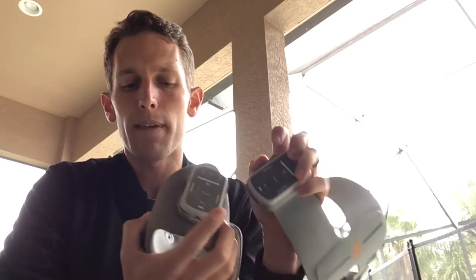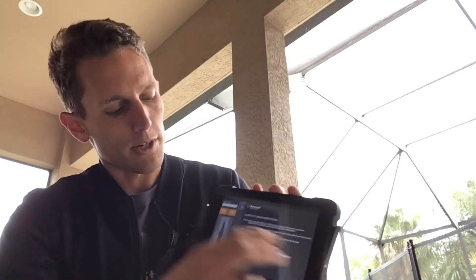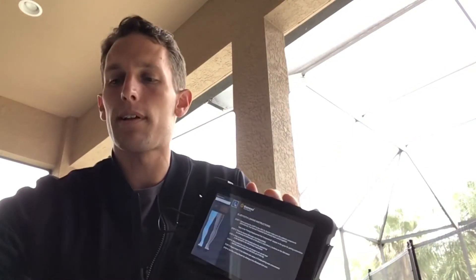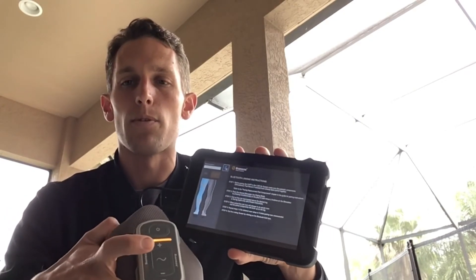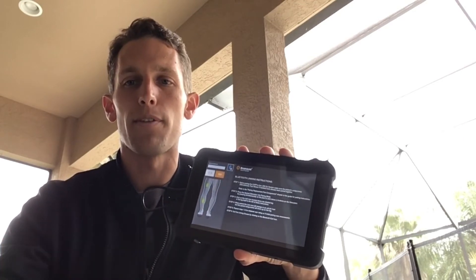Once you hear that beep, they are paired with each other. Then what you do to pair them both to the programmer is hit the Bluetooth button, then select which side you're dealing with. In this case it's the right side — you do plus and minus with only the lower cuff and hold it close to the programmer until you see both are connected.